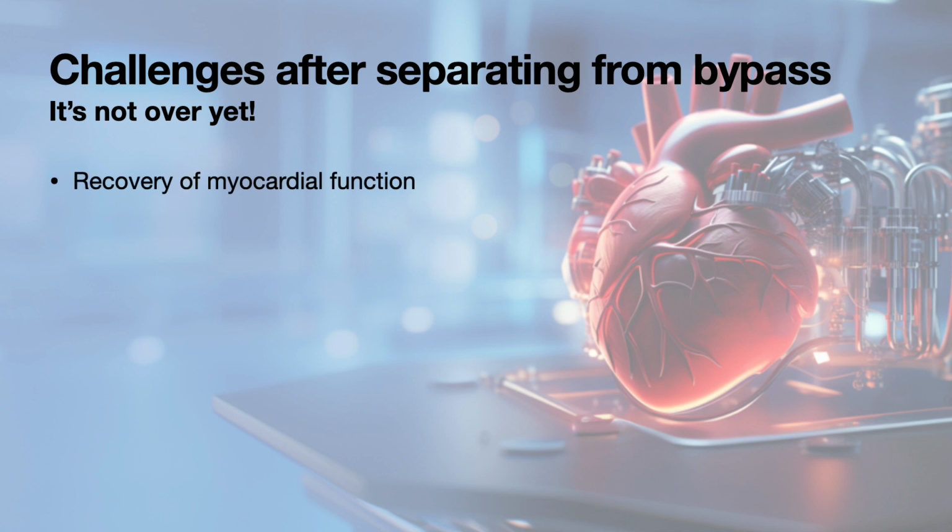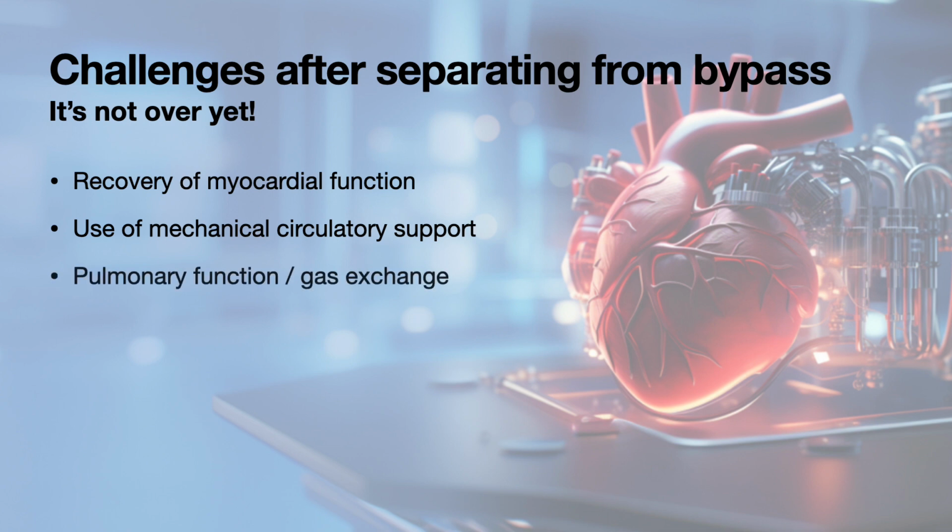The period of time around weaning from cardiopulmonary bypass is fraught with potential problems. In addition to getting the heart to function properly after reperfusion, a task which may involve the use of inotropic or mechanical support, we must also deal with some relatively common sequelae of cardiopulmonary bypass. A certain degree of pulmonary endothelial dysfunction can be anticipated in addition to the atelectasis expected after having the lungs deflated during the bypass run.